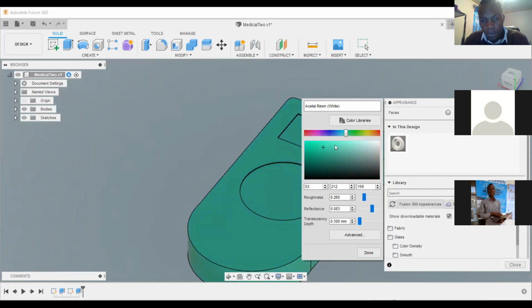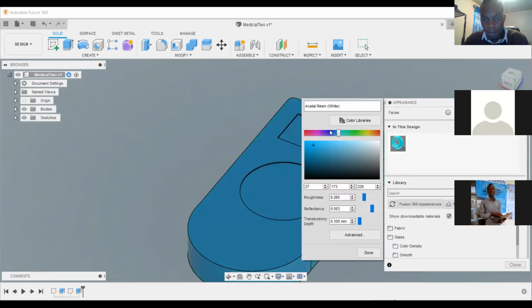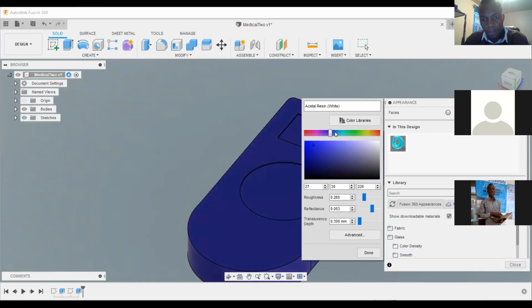So like that blue isn't that bad. Or you double click on the material. Maybe you want it to be deep blue or purple. I don't know. Just do the color that you want.